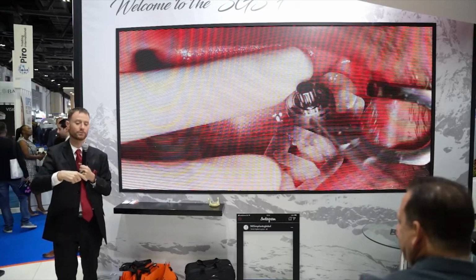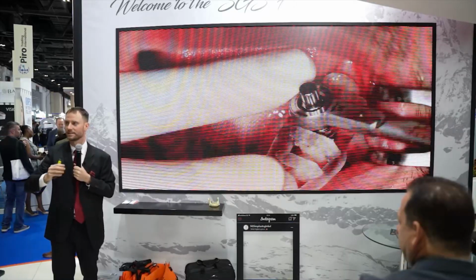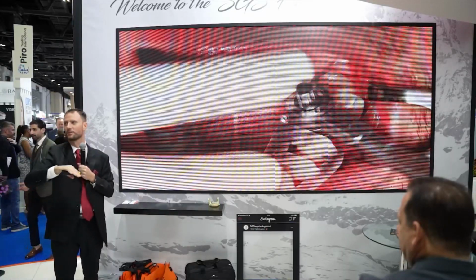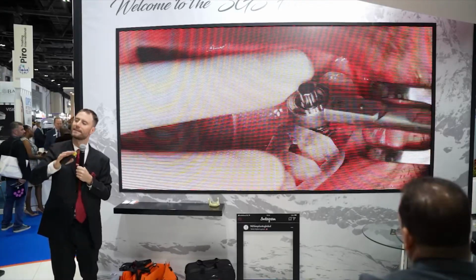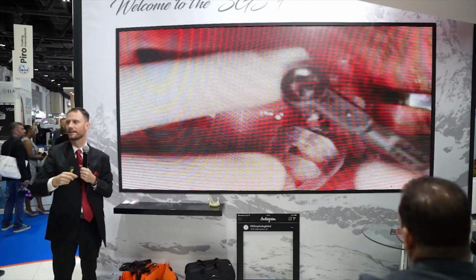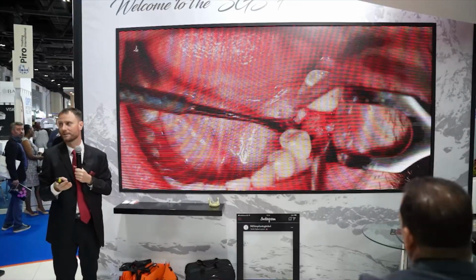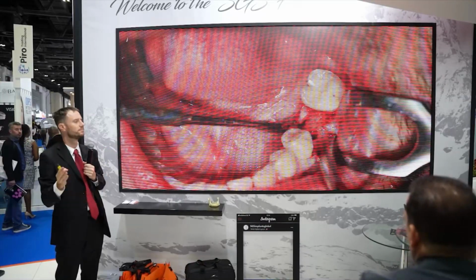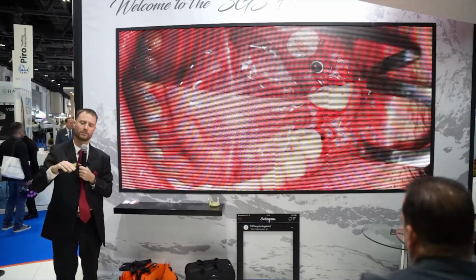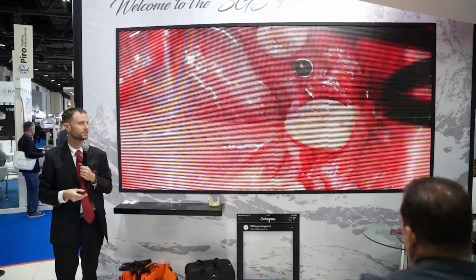The only thing I've seen, if I really put it onto hard bone, I fix it. If you do several implants, everything is good, and in the end, it's difficult to remove your guide because everything is so tight. You anchor the whole thing. So I better, when I put one implant, remove the guide, have a look, and then put the other. I don't leave it in there like that because it's really hard. It's hard bone, hard implant, everything. And then you're there. After that, the same way, cover screw, suturing. Simple thing, no extra complications.